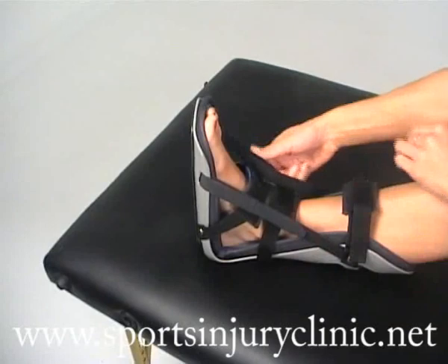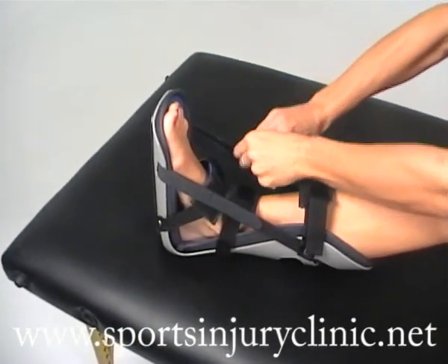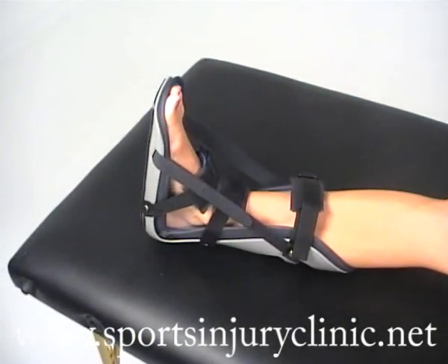Once secured in place, the splint is worn overnight and is a highly effective product for the treatment of plantar fasciitis.